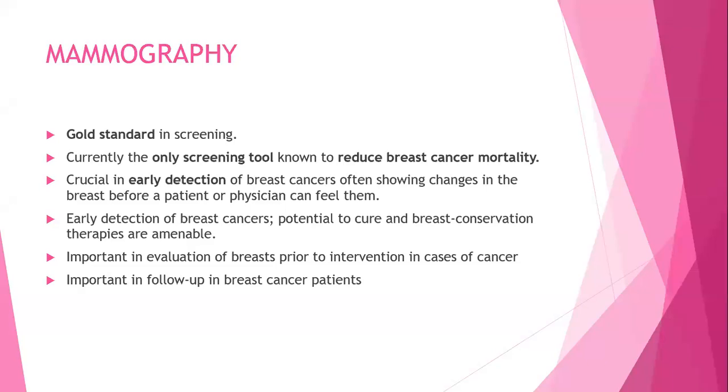Mammography is also important as a baseline examination in patients who have been found to have an abnormality, whether through palpation, and sometimes we've seen patients who've had biopsies, then they come back for imaging, or had surgery and come back for imaging. But to have a baseline study, even for follow-up of these patients, it is important to have this mammogram done prior to any intervention. So again, we go back to that role of triple assessment. You have the clinical breast exam, you have the imaging, you have the pathology, and then the patient is managed.